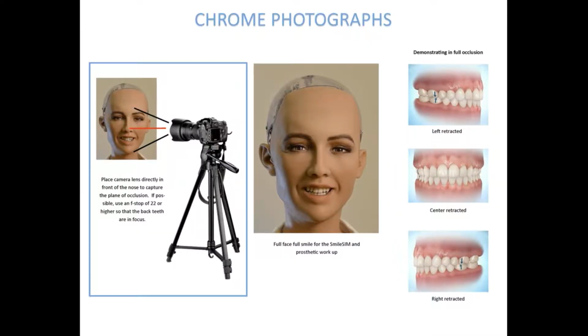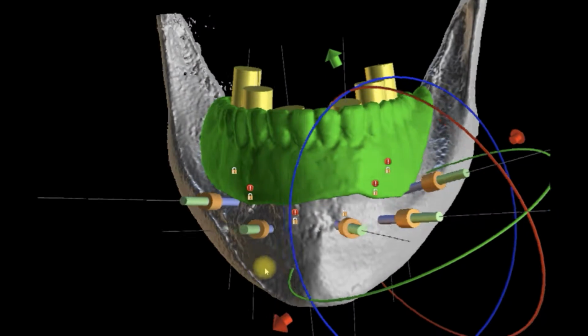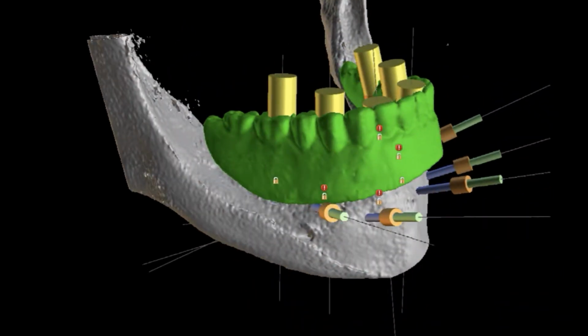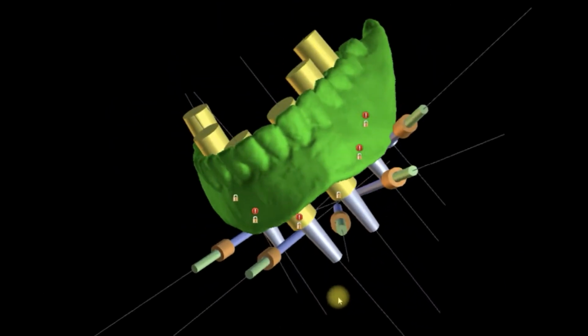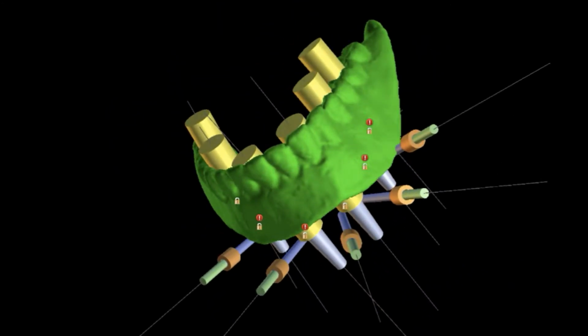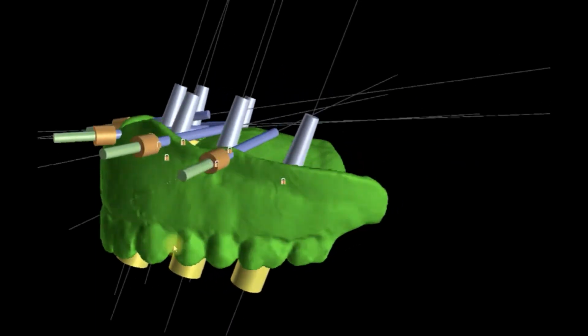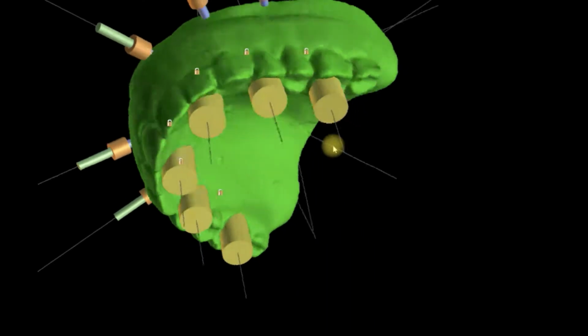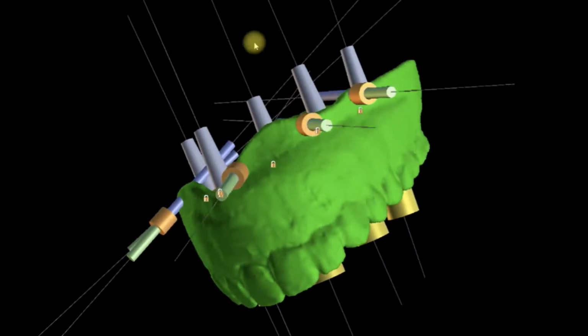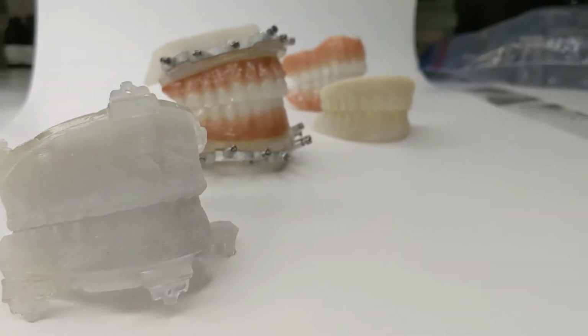With these sets of DICOM and the standard chrome photographs, we will prepare the case for the online meeting, placing the implants in the ideal position according to the work authorization, and then we'll host an online meeting with the doctor and finalize every implant position and tooth position, bone reduction levels, etc., until the doctor is 100% satisfied. Then we will go into production. Once the online meeting is finished, we will take 10 days to fabricate the chrome guided smile for surgery.